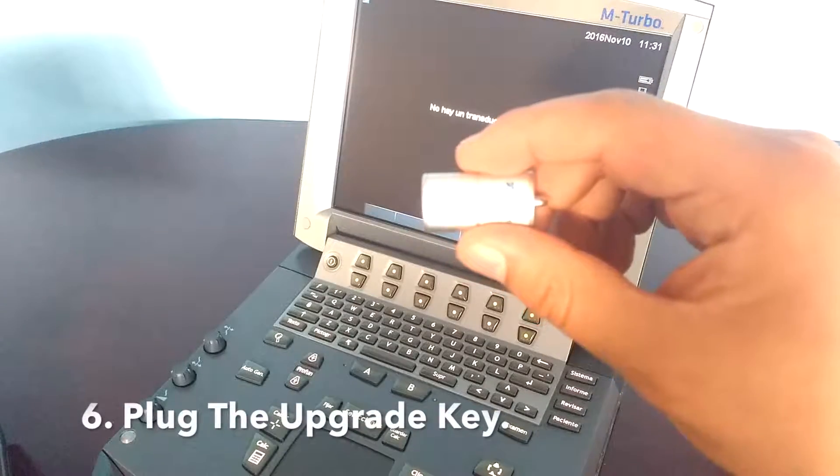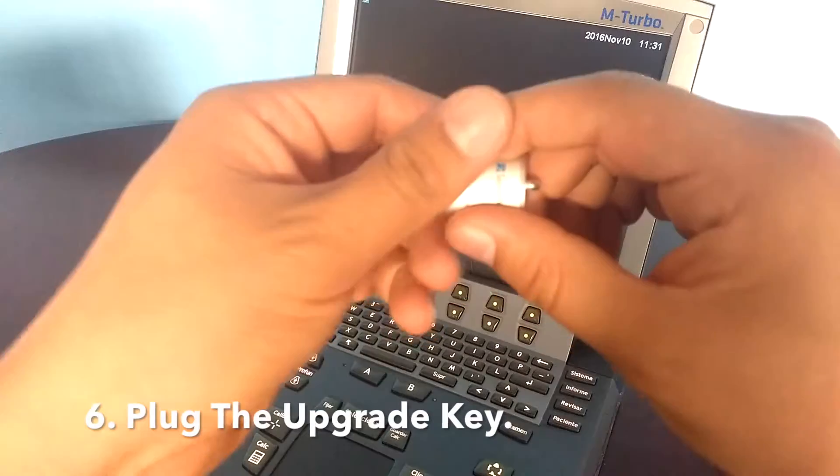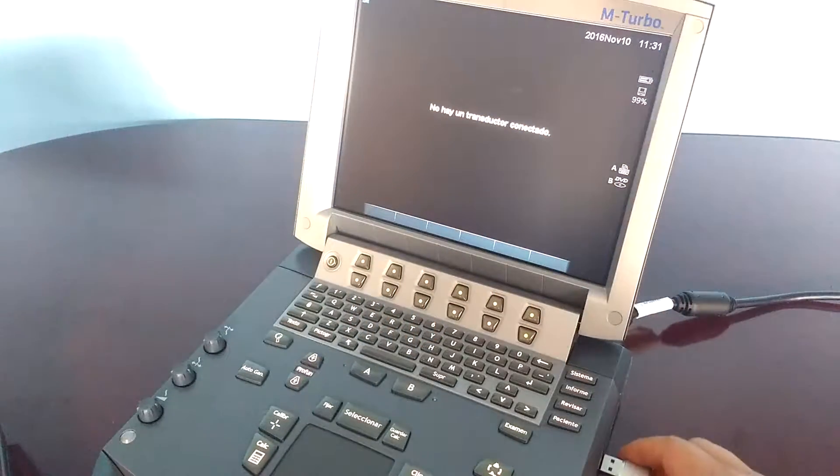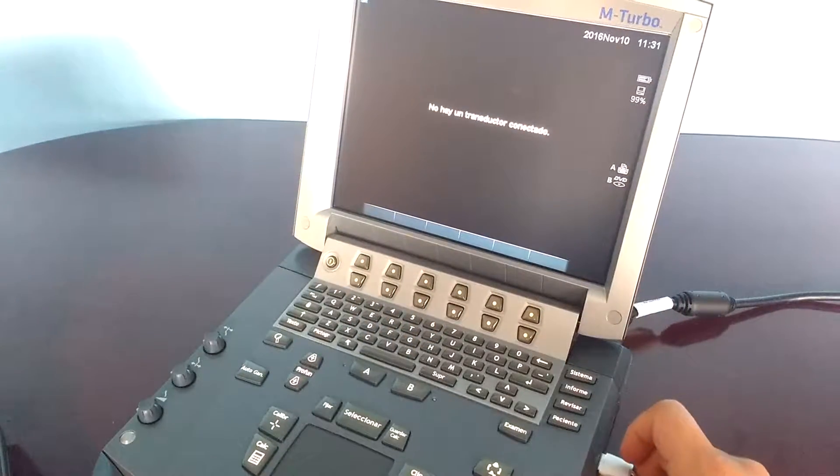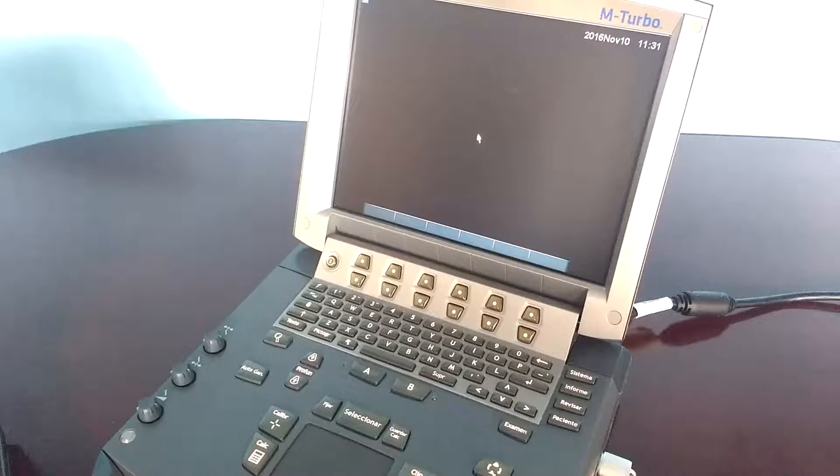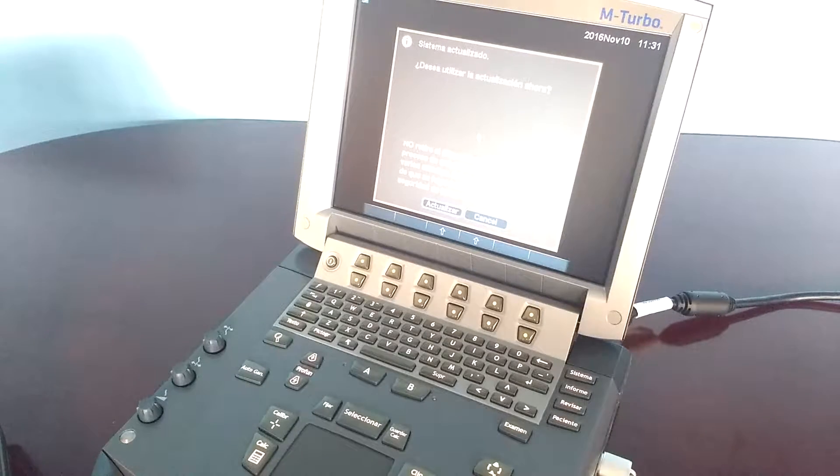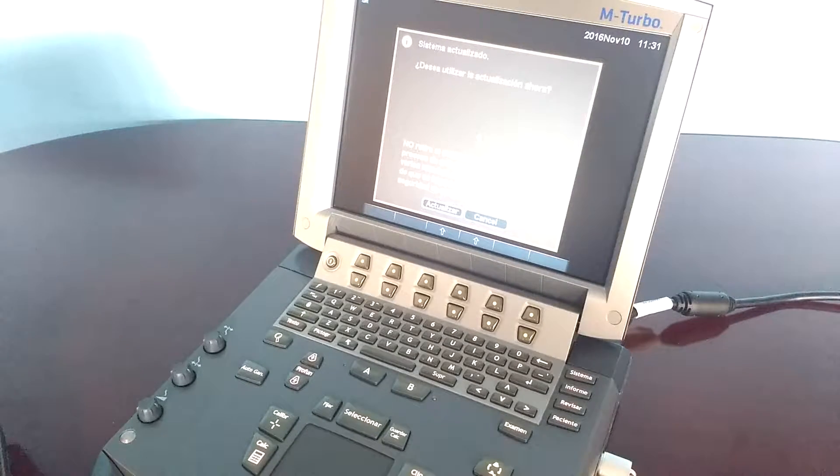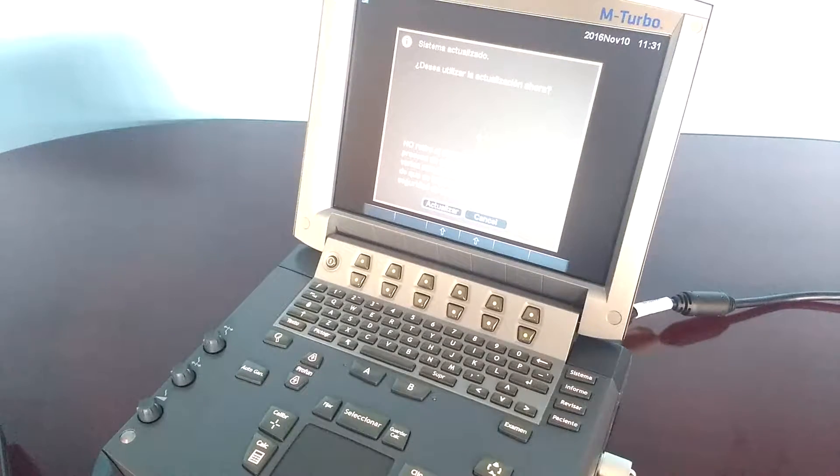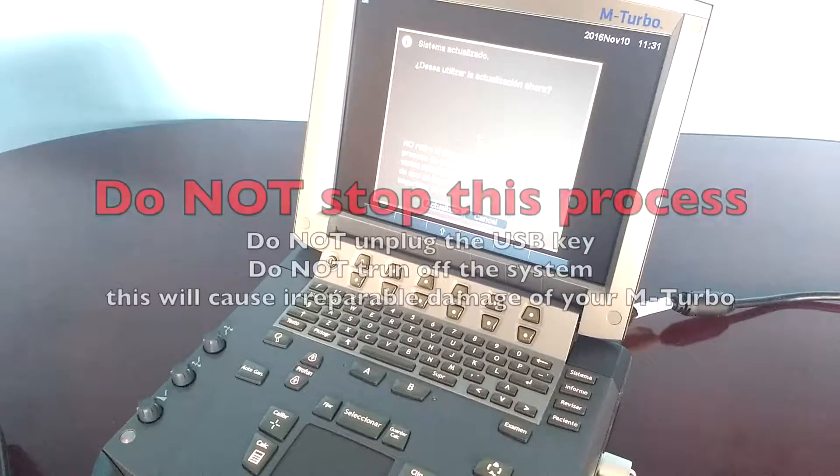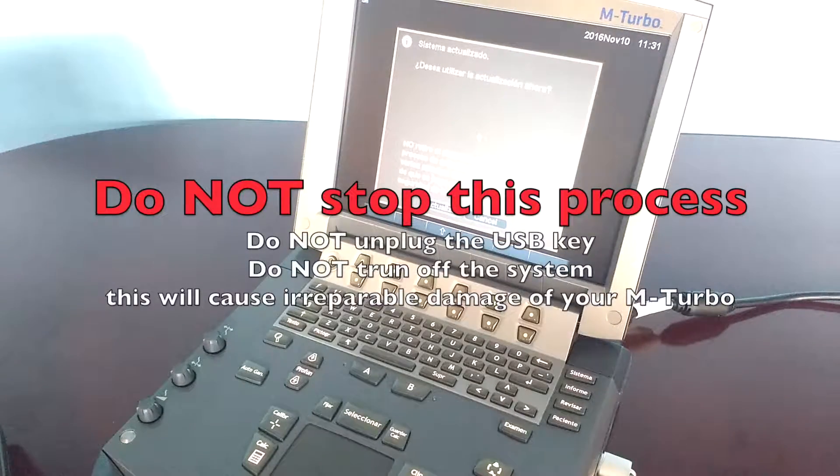The USB port: It's very important to not unplug the USB key during this process. This will cause irreparable damage to your system.